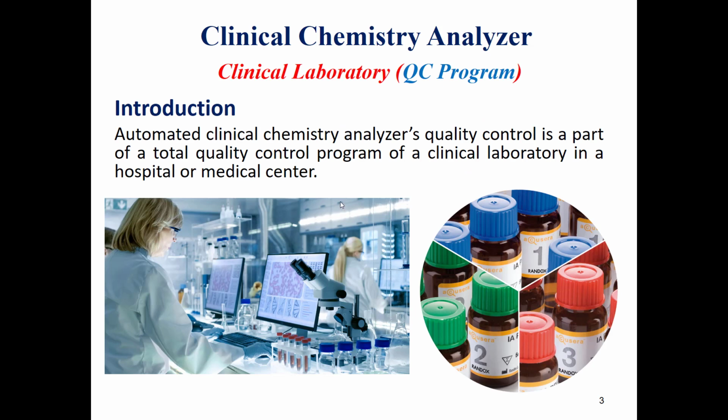So the quality control program of an automated clinical chemistry analyzer is considered as a part of the total quality control program of a clinical laboratory in a hospital or a medical center.